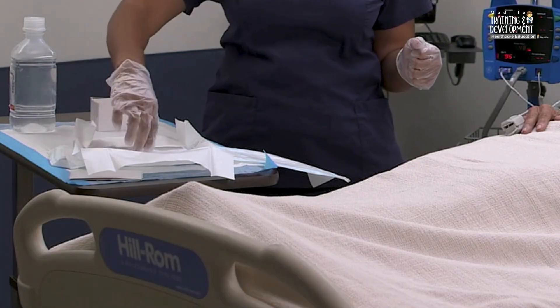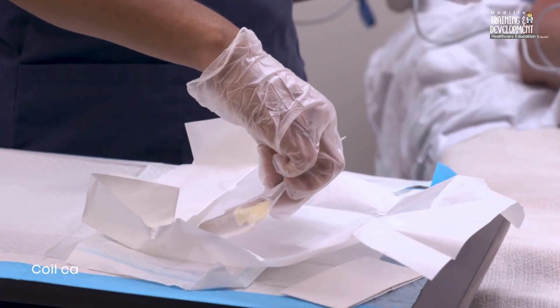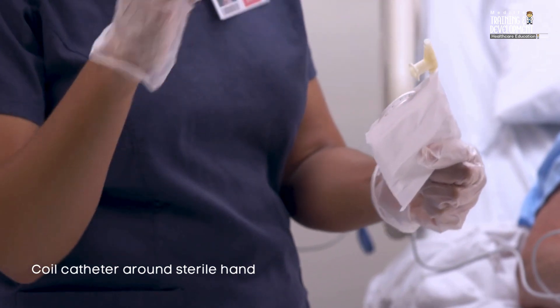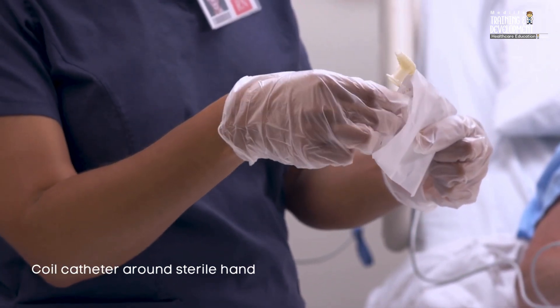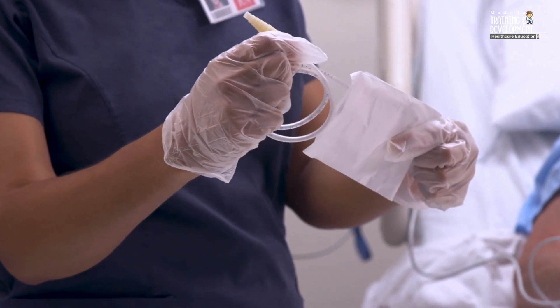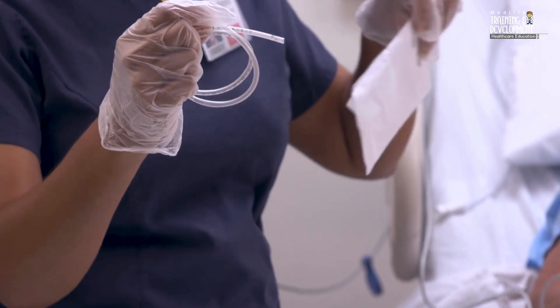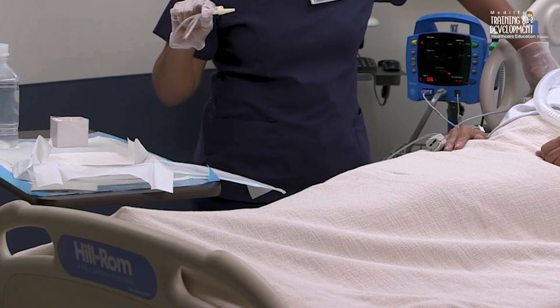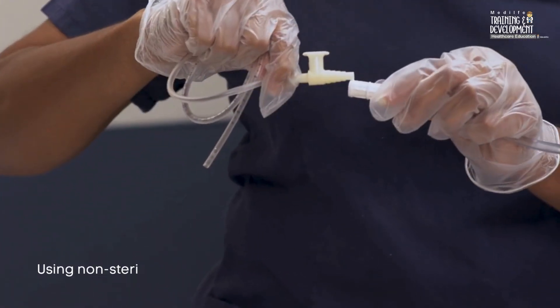Pick up the sterile suction catheter with your dominant sterile hand. Coil the catheter around your hand to prevent contamination that could occur if the catheter accidentally touched another object. Using your non-dominant non-sterile hand, attach the catheter to the tubing.